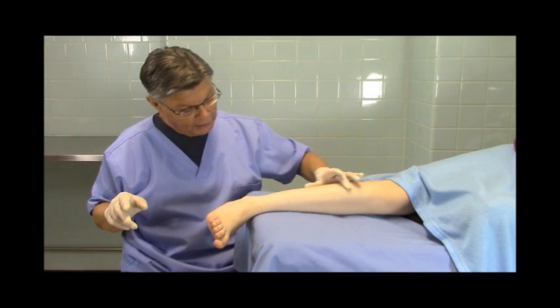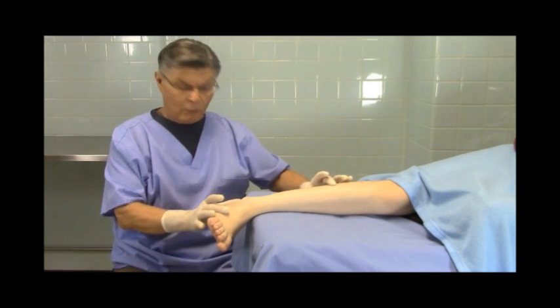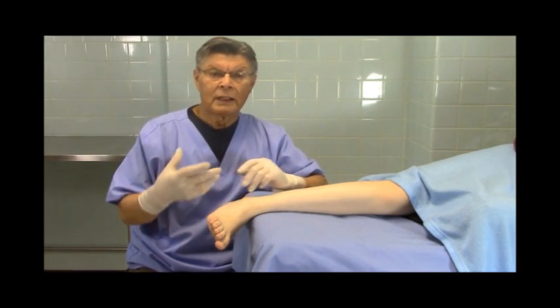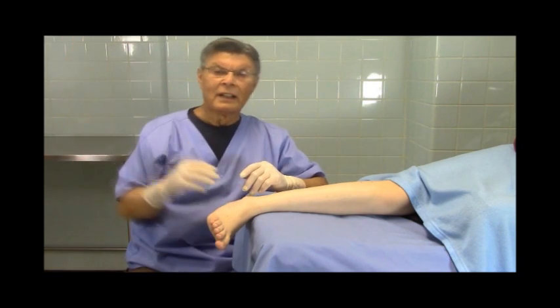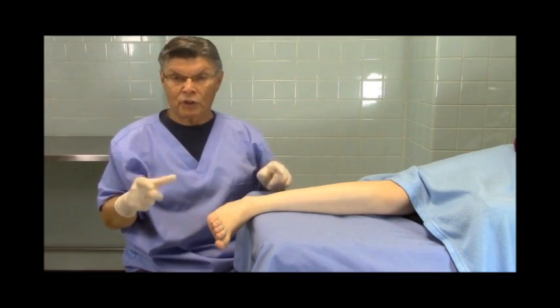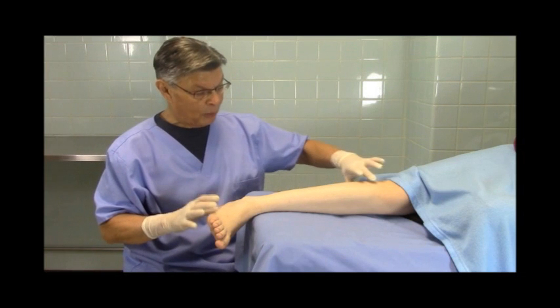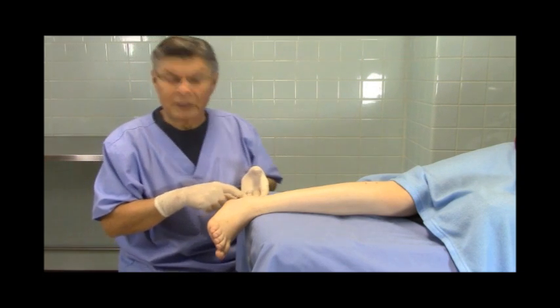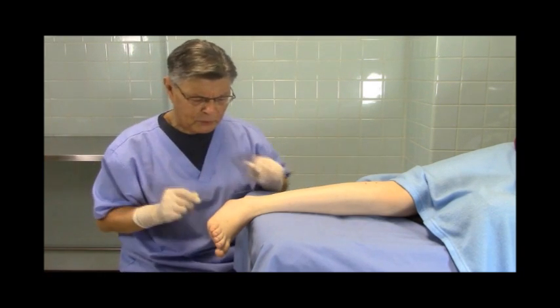This will give you anesthesia all down the lateral aspect of the leg. It's exceptionally good when you're doing any work in that area. The way we position our patient is the way that we do surgery. I've trained hundreds of residents — the tallest was 6'7" and the shortest was under 5 feet. Whoever is doing the surgery should get the table to a comfortable level where they can see everything. By putting the patient in this position, you can reach all of the lateral aspect and do procedures like calcification of the Achilles tendon.